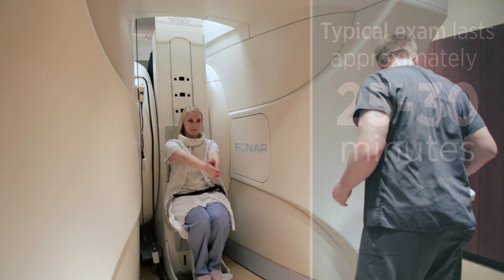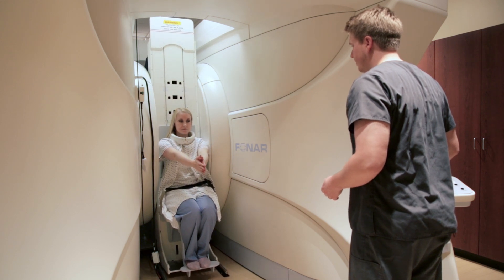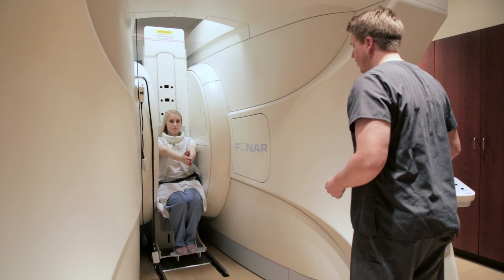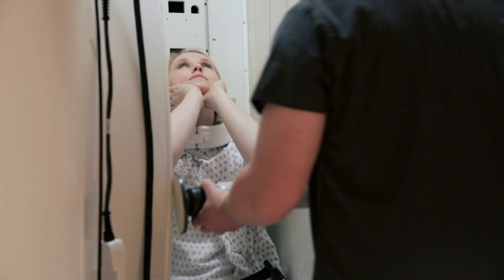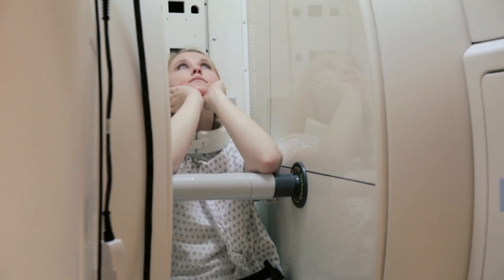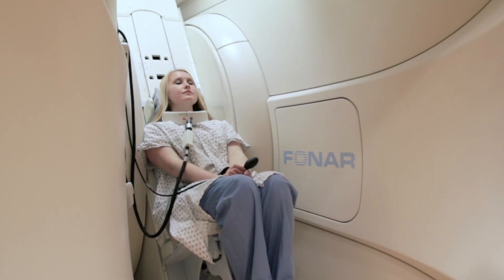Then what we'll do is set them up for the flexion and extension sequences. With the flexion exam, your head is going to be tilted down. And then with the extension sequence, your head is going to be tilted back. Those each take about a minute to a minute and a half to perform. We make those quick because we know that the patient is going to be less comfortable during those scans.